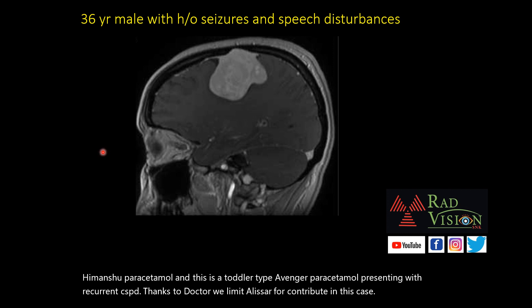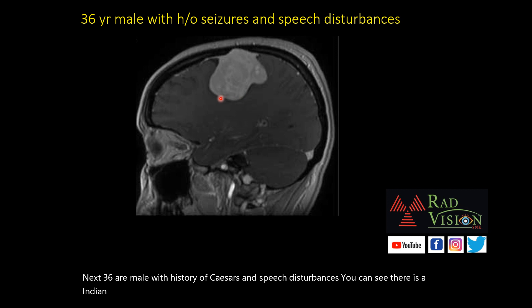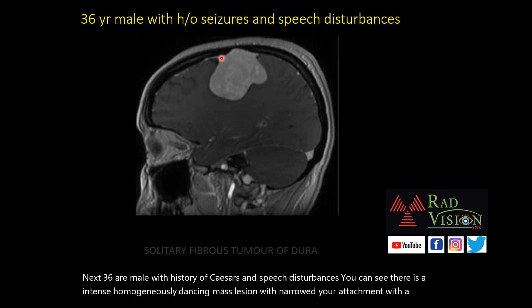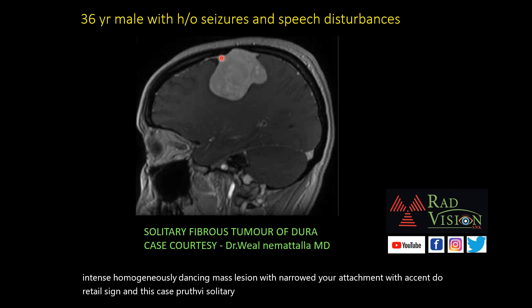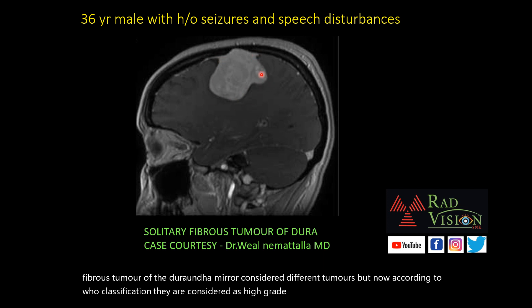Next case: a 36-year-old male with history of seizures and speech disturbances. There is an intensely homogeneously enhancing mass lesion with narrow dural attachment and adjacent dural tail sign. This proved to be a solitary fibrous tumor of the dura. Previously, solitary fibrous tumor and hemangiopericytoma were considered different tumors, but now according to WHO classification, they are considered high-grade solitary fibrous tumors.